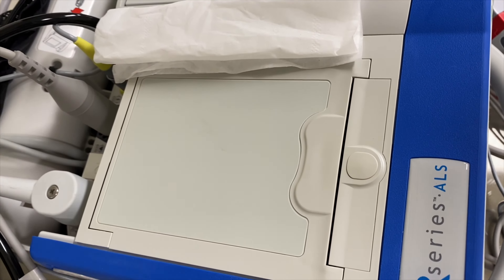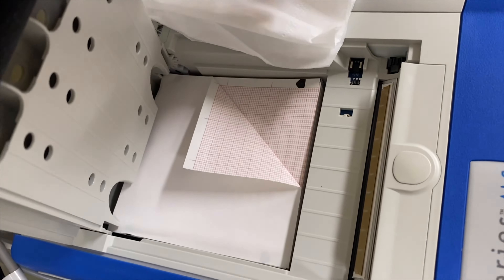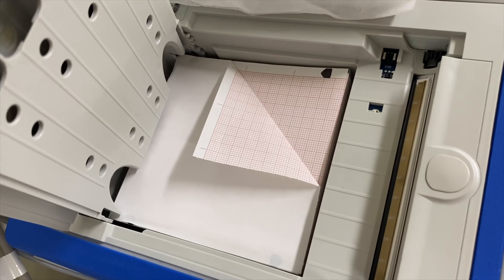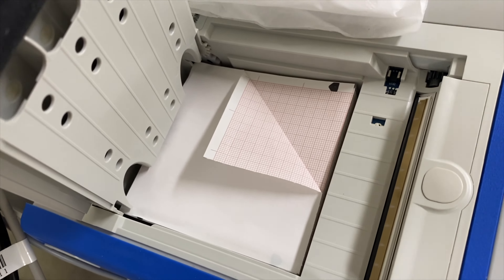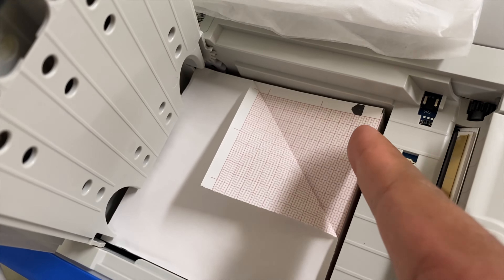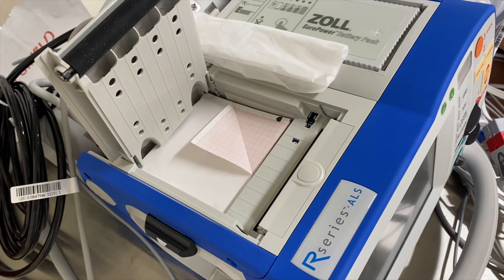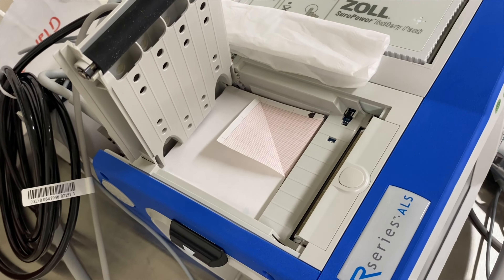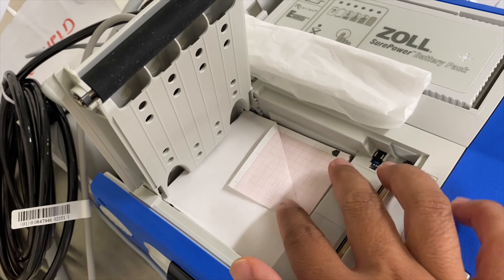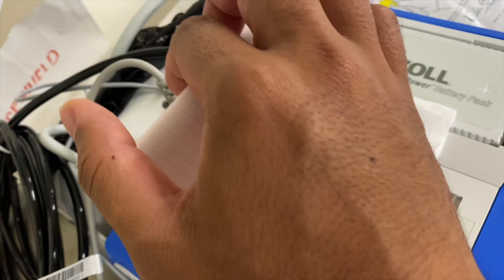On the other side will be where your paper recorder is going to be. If you press this button here, it will reveal your paper. Note that when you open up a new packet, the first page will always be folded. You can see this arrow pointing away from you. So when you are feeding it into your paper recorder area, you want to make sure that the arrow is pointing away from you, then pull it up and feed it to your paper recorder.